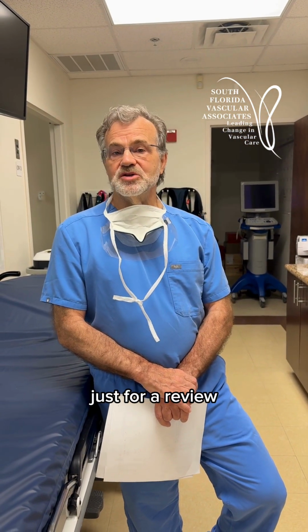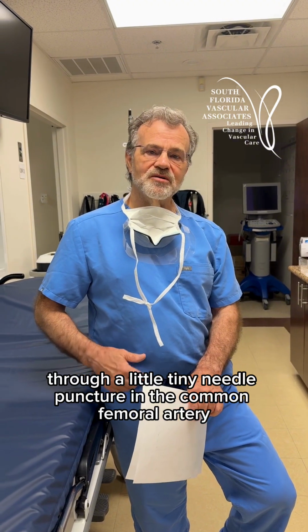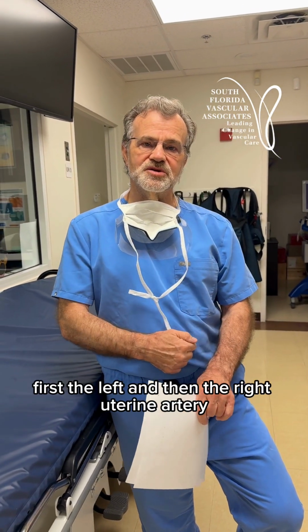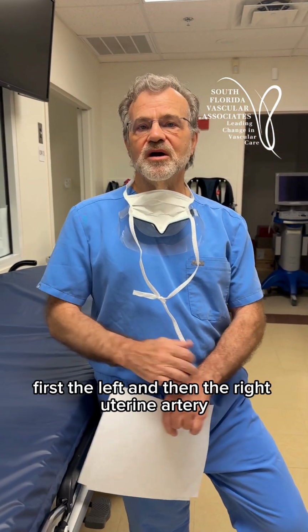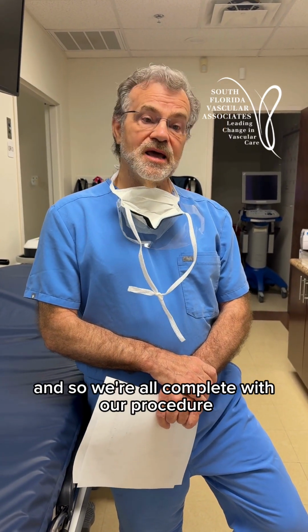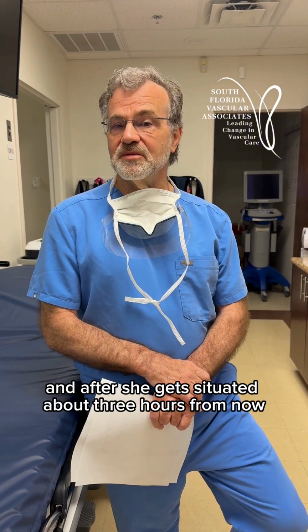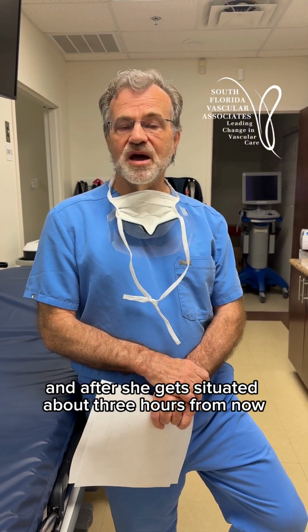Okay, we're all done. Just for review, through a little tiny needle puncture in the common femoral artery, we threaded our catheters into first the left and then the right uterine artery. We injected particles to stop the blood flow to the uterus. And so we're all complete with our procedure. The patient will be going to recovery, and after she gets situated, about 3 hours from now, she'll go home.